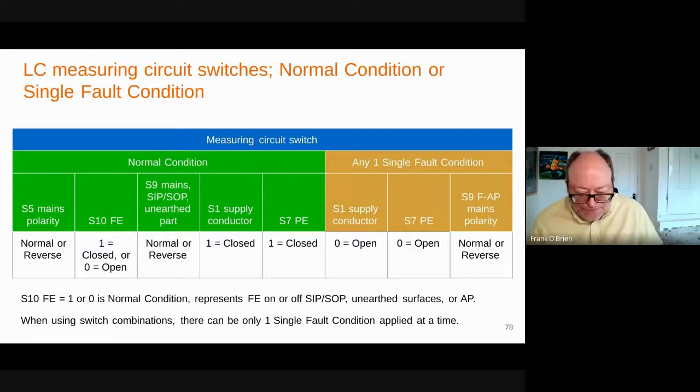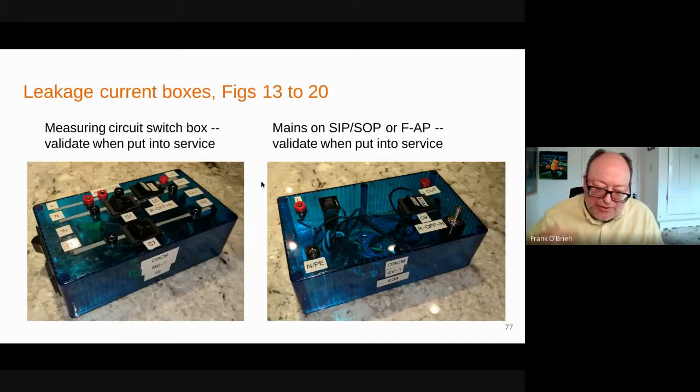So however you do it, when you're doing production testing, earthing and leakage is part of 100% production. Of course, you're going to buy commercial equipment, and there's programmable equipment, logging equipment. So you're going to get all that fancy stuff. But for your validation or verification department within the research and development, you might want to have a nice flexible approach, and it's not going to be a pre-programmed approach. So with test labs as well, it needs to be more manual.